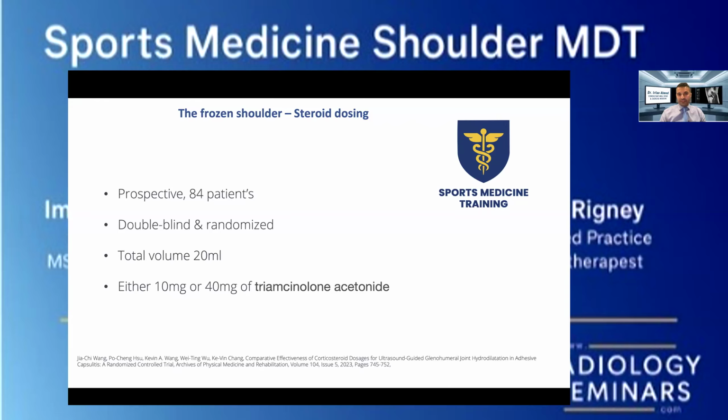Now, often when we think about patients, we think about steroid dosing and we think about, do no harm, treat the patient, improve their range of motion. But we want to think about perhaps doing a steroid injection or those procedures under ultrasound guidance. This is an interesting paper from 2023 that gives us a bit of food for thought about the kind of dosing that you might think about in hydrodistension.